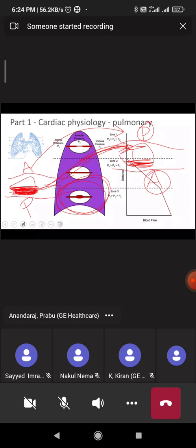They have practiced it properly, they will be keeping this entire system simple so that it is easy for them to prone the patient. So proning is really helping us. That is, we are actually trying to use this chart, what you are seeing on the slide. We are trying to make the non-dependent area a dependent area and the dependent area a non-dependent area. For some time we will put them in the prone position and sometime we turn them back to the supine position. So this is actually reducing the inflammation and reducing the total alveolar damage. So we are trying to rotate the alveoli so that one single alveolus is not taking the load throughout the day. That is the idea of doing proning.